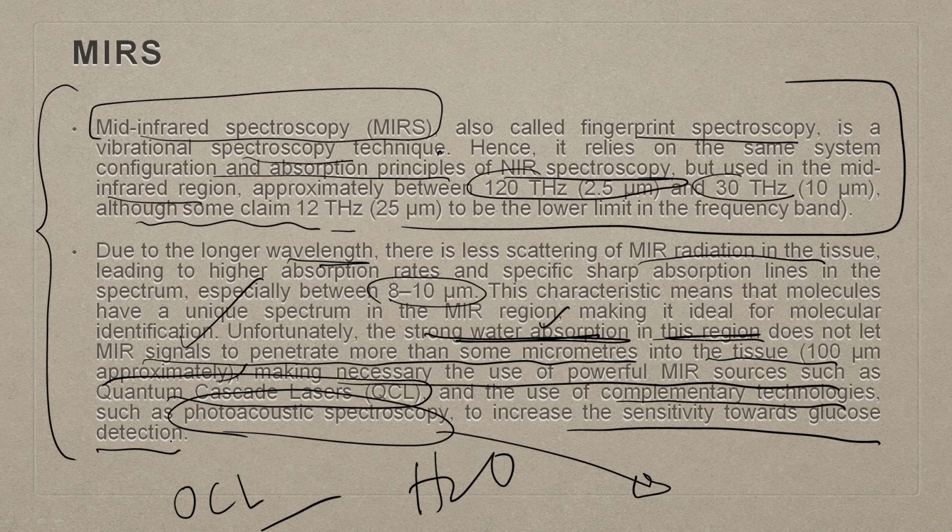So, water is a big challenge. Always remember, when we are working on an aqueous system, and all living forms are in an aqueous environment, where water is the major molecule in which everything is suspended, these kinds of spectroscopic challenges are rampant, because water has a very peculiar absorption zone, and depending on how small the water concentration is, there are a lot of changes which occur in its properties too.